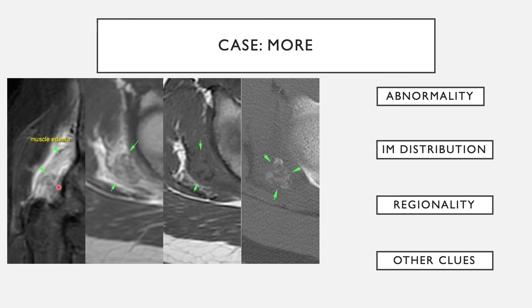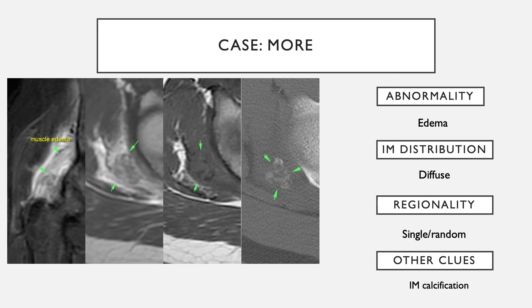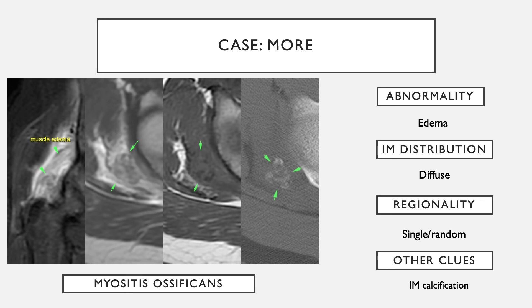In another case, there is diffuse muscle edema involving a single muscle. Looking carefully, there are slightly more heterogeneous irregular areas on T2 and T1 with dark areas, and CT shows calcification within this. If you have intramuscular calcification with extensive edema, you want to think about myositis ossificans. This is an example of myositis ossificans.